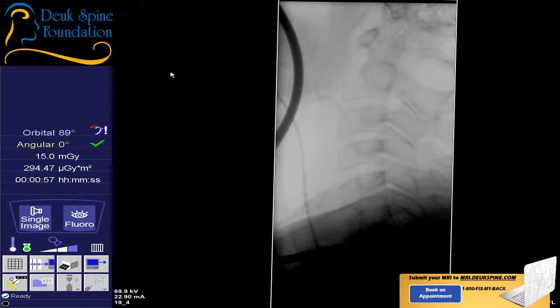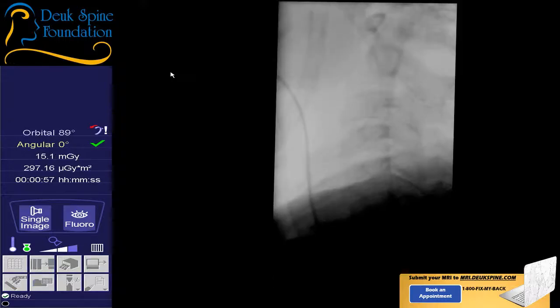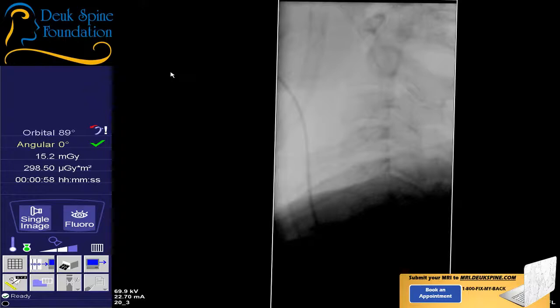So that went well. Once again, that was 6-7. We've already done 5-6. Now we have 4-5 to do, the last one. So hold on, let's get everything set. And I think you're okay where you are with the fluoro. We're gonna need the neck pulled one last time. Just don't pull yet, guys. You gotta let them get the head in neutral first.